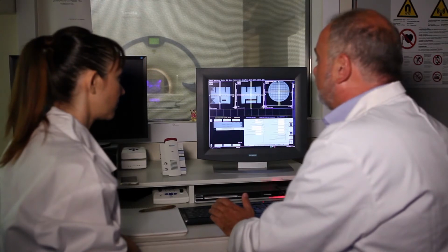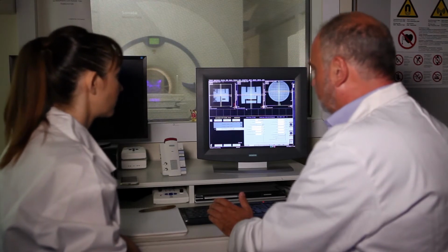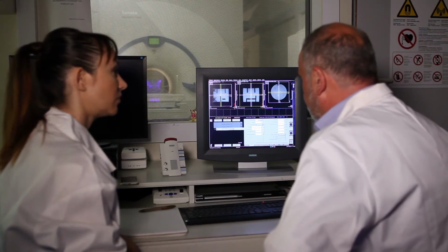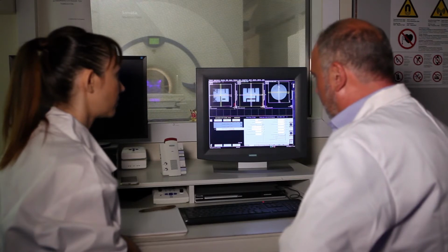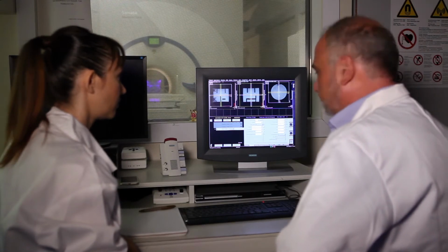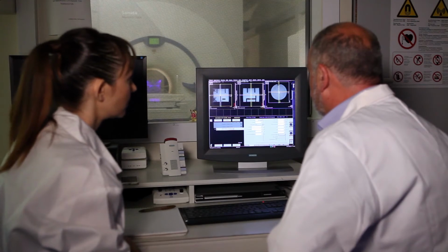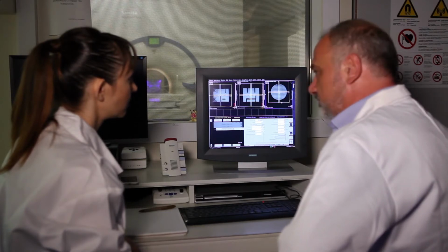Okay, what we do, we take the localizer scan, we unzoom in order to be able to view all the levels, in all the scans. And that's exactly as you can see here. First thing we have to do is to move the center of the slices. You can see here the cross sections of 3 slices. This is the sagittal slice, this is the coronal, this is the axial. Okay? So we move the center of this slice to the center of the phantom. That's the first point. Then we take the other slice and we put it again at the center. Okay? We can do it digitally.